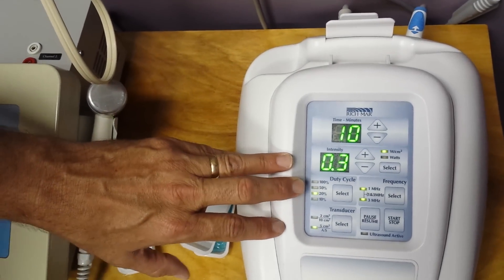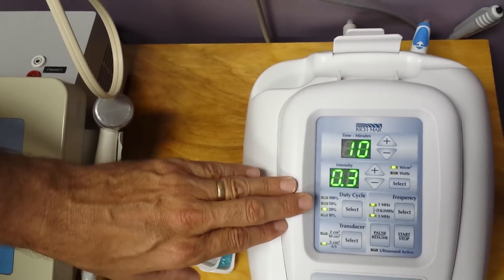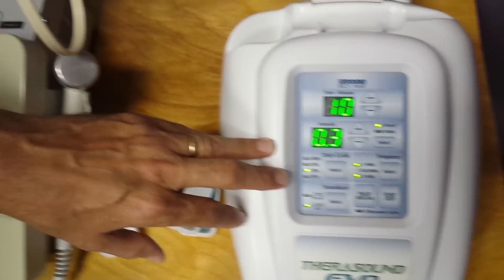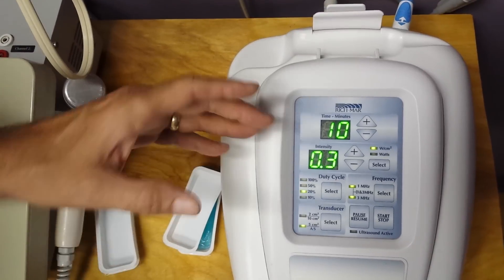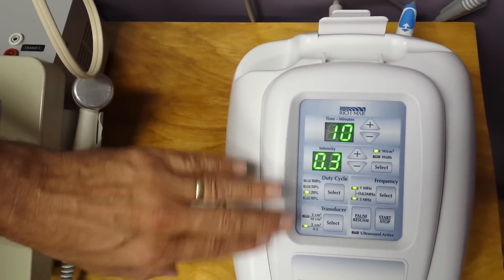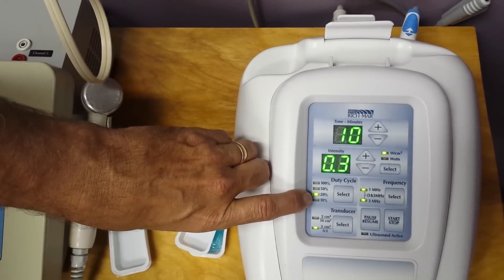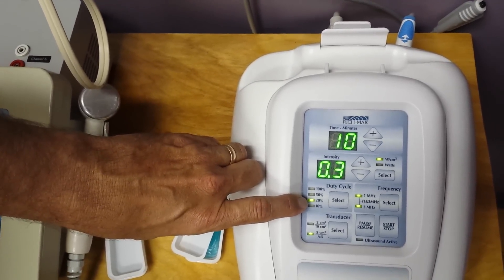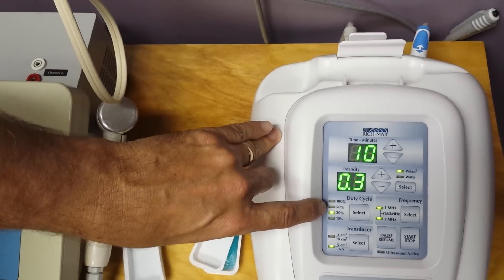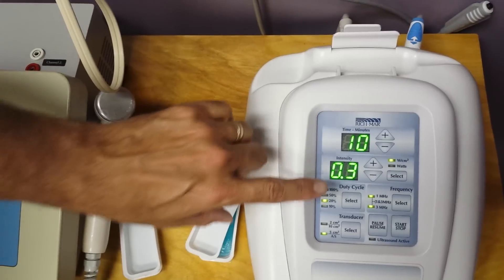Let's talk about duty cycle. The question we have to answer is when did the injury occur? If it just occurred, we call that acute — our office defines acute as under 14 days. Tissue is much more receptive to ultrasound therapy in the acute stage, so we put the duty cycle between 10 and 20%. If the problem has lasted between 14 days and 6 weeks, that's subacute — we can move the duty cycle up to 50%. If it's been over 6 weeks, we use the constant setting at 100%.